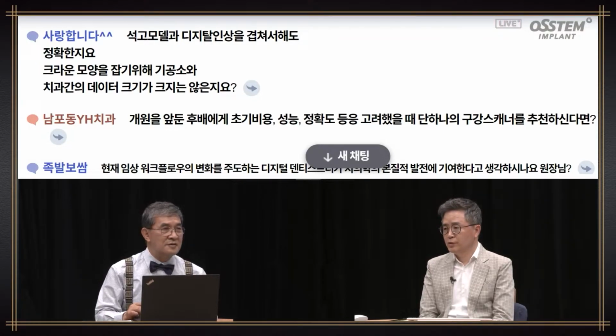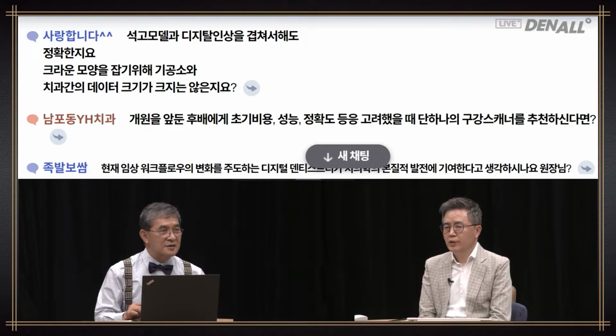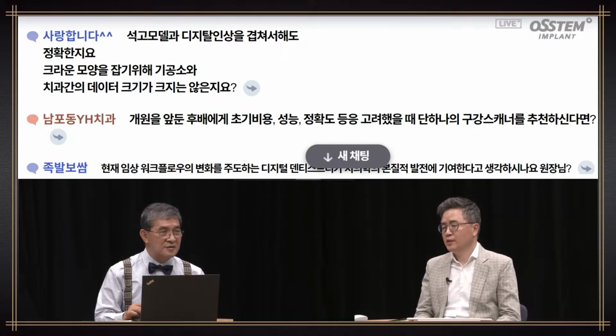But if you take analog impression and pour stone, if you change rubber impression and stone, and if you make a second model and third model, bridging the gap between these models is very difficult. If there is equipment used by the lab, or if you're aware what kind of stone model the lab uses, we need to refer to it. We need to match that. Only then will it be meaningful. Or else there's so much variable that we can't define what went wrong where.